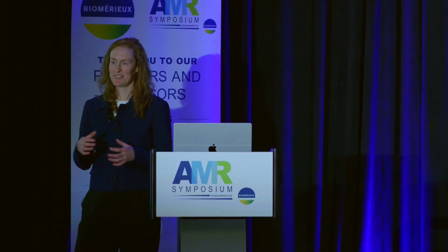Yeah, I think it's going to become more of an issue, because already in our lab we see it's hard to keep up with even new software coming out for existing machines. So I think that's a challenge. I think it would be nicer if we could make our own panels, because already, for example, if I see a multi-drug resistant Klebsiella, we would do an E-test, a gradient diffusion strip, for these advanced antibiotics, and that's not necessarily going to be on the panel already provided by the manufacturer.